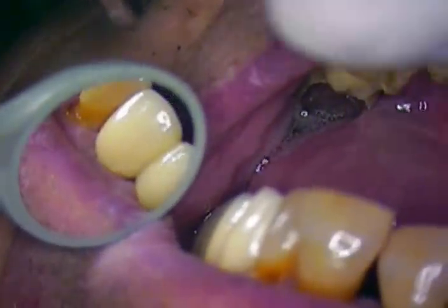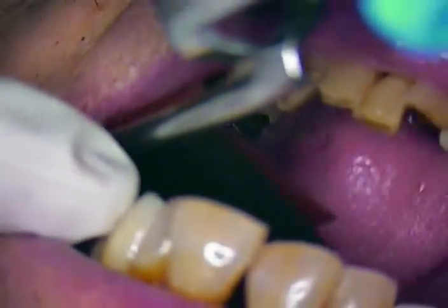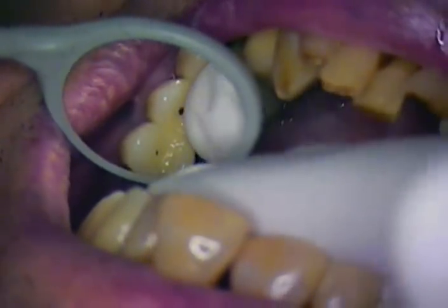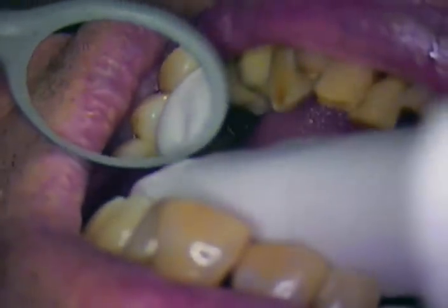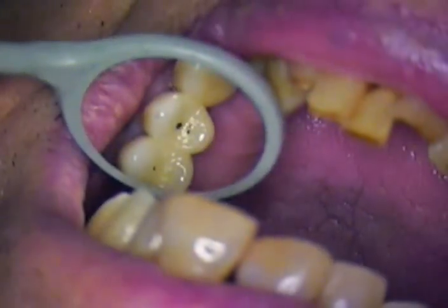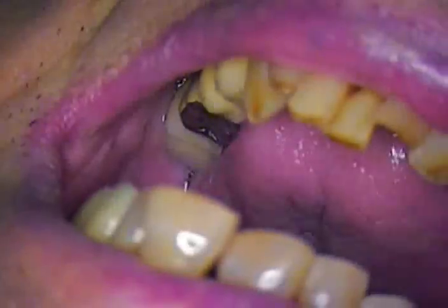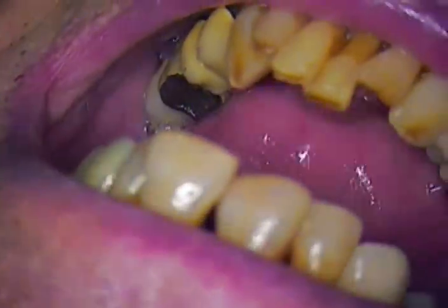I don't have any complaints as far as overall structure. Now we'll check the function — go ahead and close down gently, tap tap tap. We'll see a little mark that we have to adjust. Many times what I'll do instead of making the adjustments now, we'll torque down the implants, then place the bridge and recheck the contacts. We'll do all that in between this segment and the next. So we'll give you a station break — Doc gets a little break in the chair — and we'll pick this up when we're getting ready to cement and place some retraction cord.